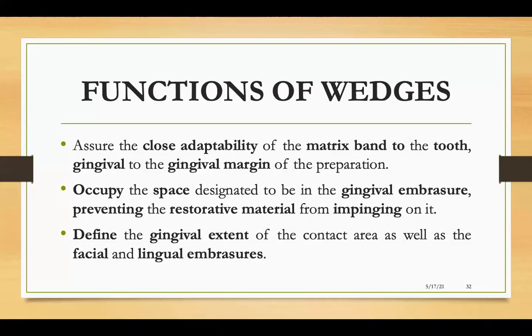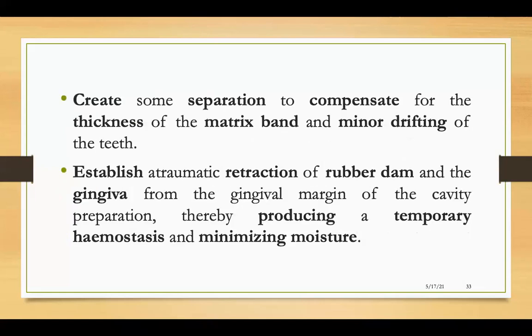There's no mugging that you have to do. Once you get hands-on with the wedges, once you get hands-on with your class 2 preparations, all of this will make a lot of sense, right? For now, all I want you to just write the objectives and functions.